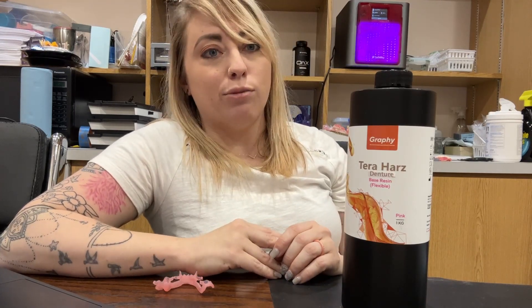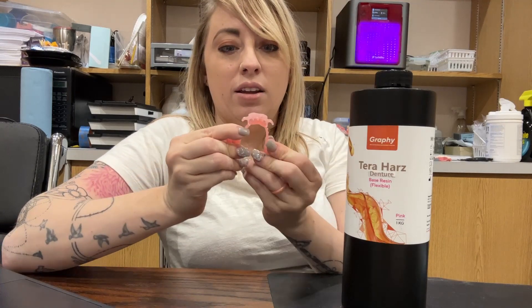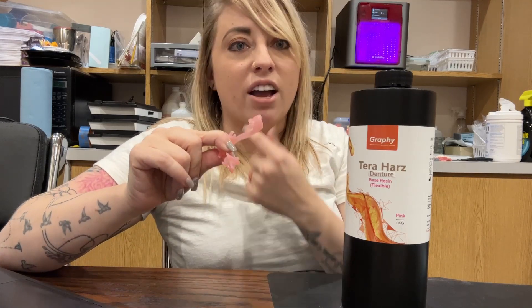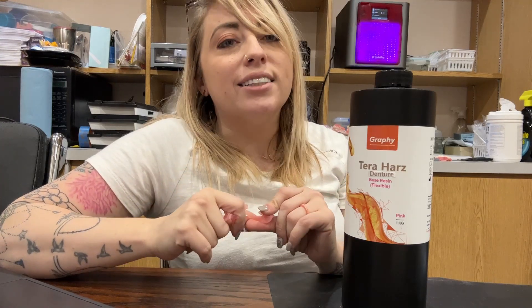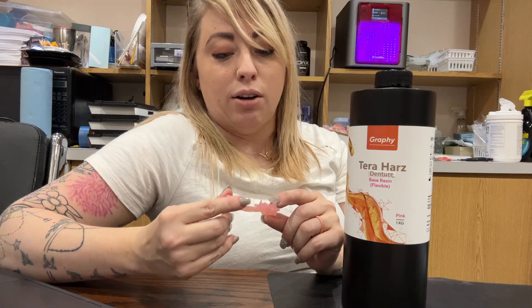My number one go-to for partials is the Graphy Terra Hers Flexible Base. This just came out and just got approval. I've been searching for it for months because if we want to 3D print a partial in the office, we want it to be a little flexible. The material is not as super flexible as Valplast or Duraflex, but it is a close runner-up. You can see it's pretty flexible. It's great for patients who would normally break off clasps or need a really thin area on the lingual side of the molars.